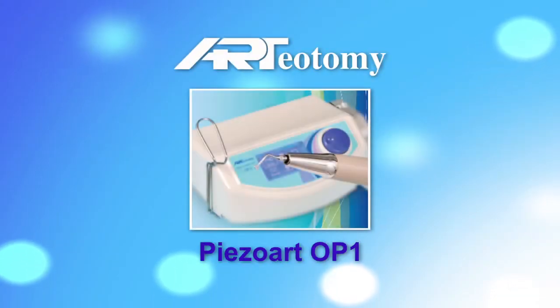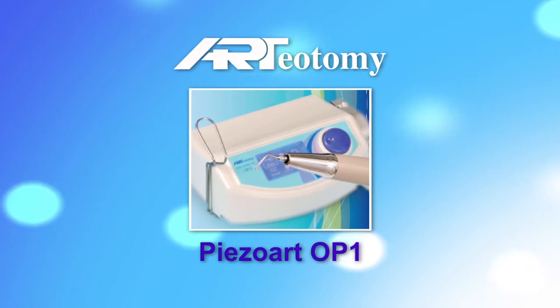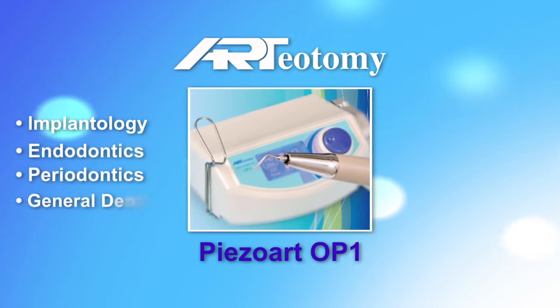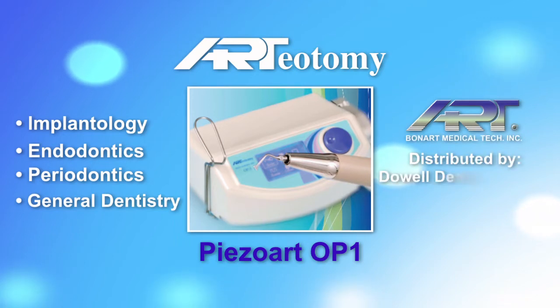Introducing the ARTeotomy Piezoart OP1, the most advanced and cost-effective piezoelectric ultrasonic surgery system available for implantology, endodontics, periodontics, and general dentistry. Manufactured by Bonart Company and distributed by Dowell Dental Products.